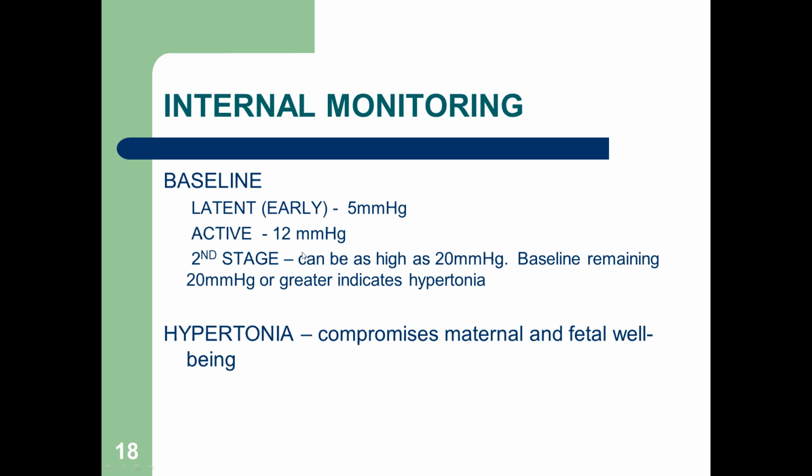Baseline, and again, I'm not going to expect you to memorize these, but anytime you insert a monitor, you're going to get a baseline reading so that you can determine if we're getting hypertonia, meaning the uterus is overstimulated, okay? Which would compromise the maternal and fetal well-being.